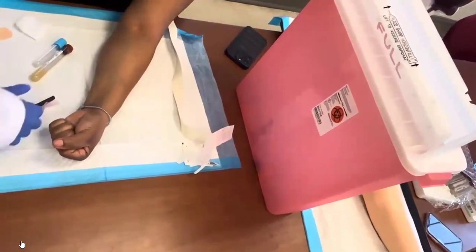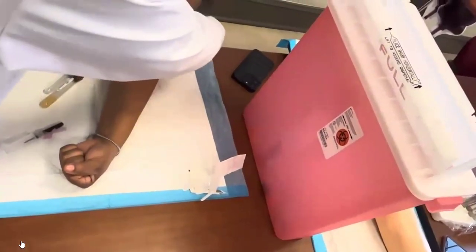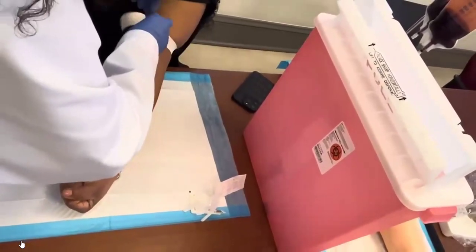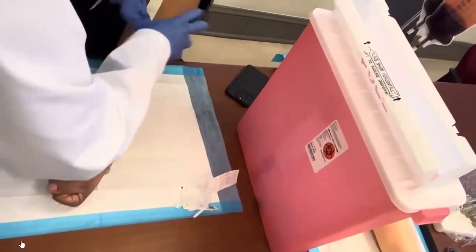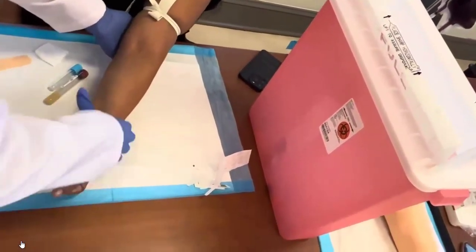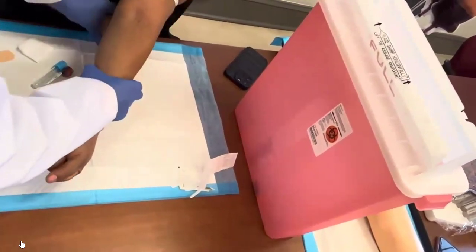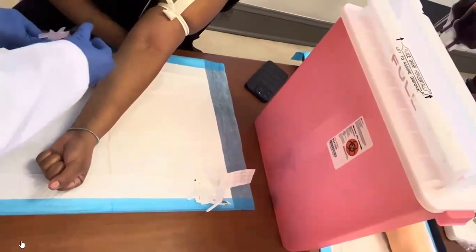All right, so I'm going to go ahead and put her tourniquet on. We don't want to put the tourniquet on until we are ready to stick, okay? So this is the last thing I'm going to do right before I stick. Alrighty, make a fist for me. And then can you take this fist and put it right up under your elbow? Right there, yep. Alrighty, so I already cleaned it.